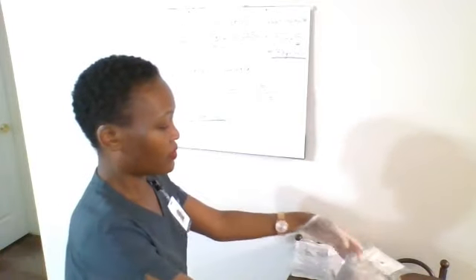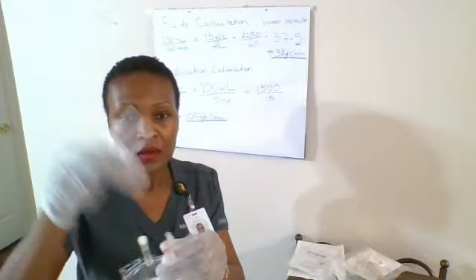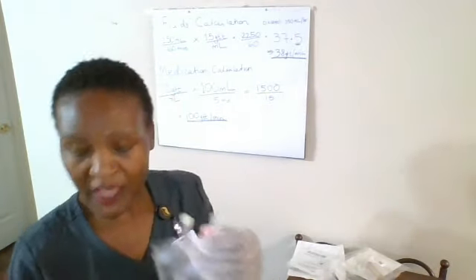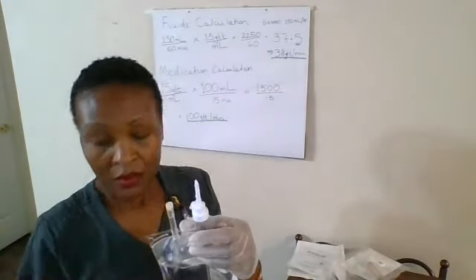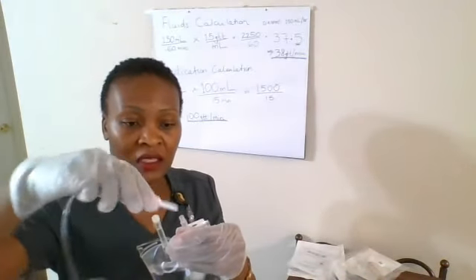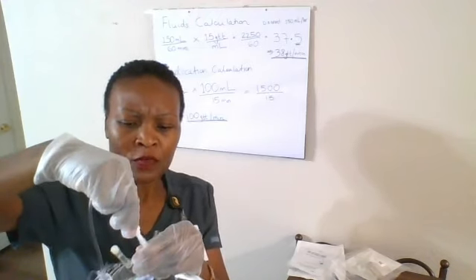And I'm going to get my IV fluid bag right here and my primary tubing. I'm going to open my IV fluid bag and I'm going to open my spike end and right away spike my IV fluid bag.